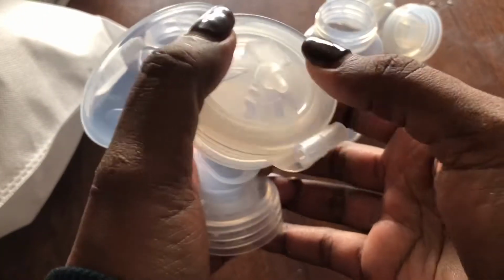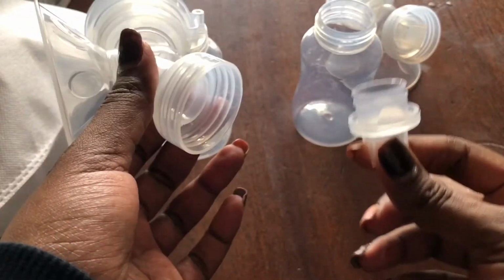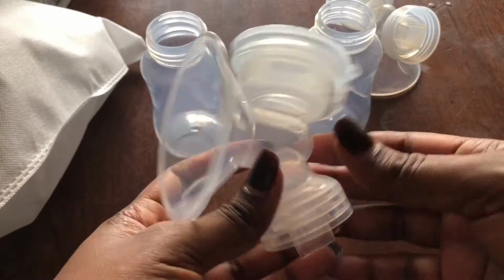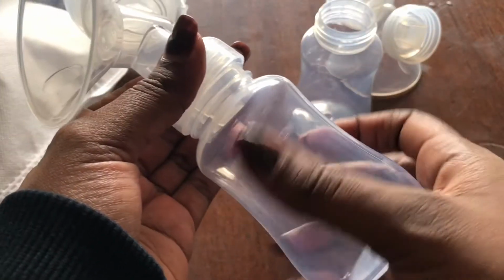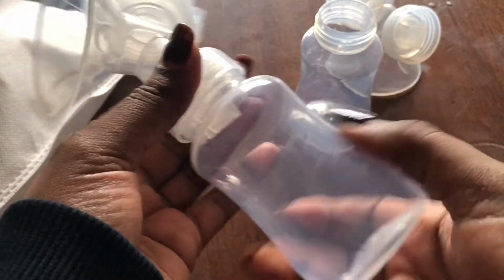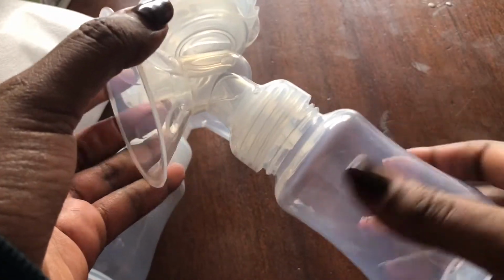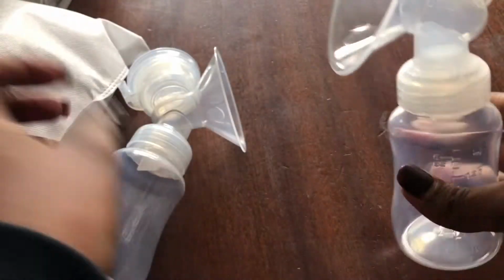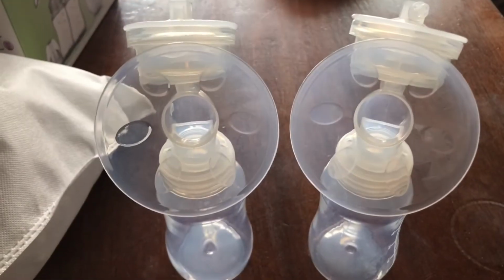It is so easy to assemble. It comes tricky, so you just have to cram and know where everything is supposed to go. So this one also goes here, same as the other one. So that's just it. What we are going to do right now is close it up, like that. Let's do the other part. I'm not going to show you everything I've done in the first bottle, because they're twinning guys, there's nothing different about it.